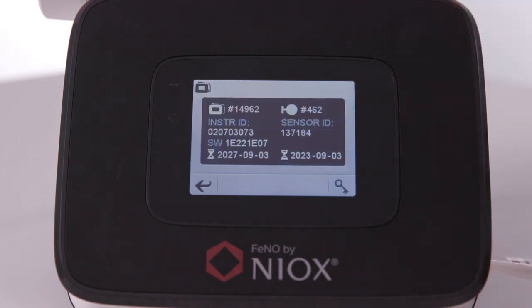Here, you have all of your device details. On the left, you have the number of remaining tests on the device, the device serial number, and the device expiry date. On the right, you have the sensor number of remaining tests, the sensor serial number, and the sensor expiry date.